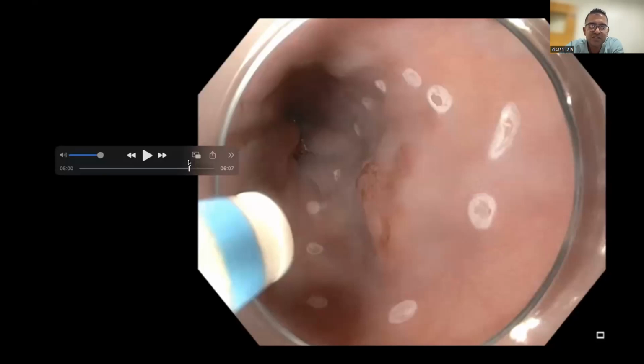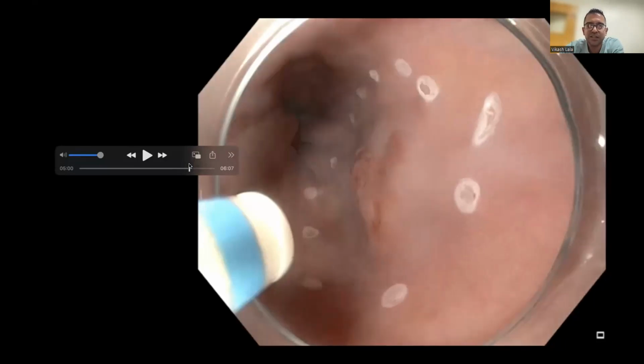But why I chose this case is to highlight again the importance of finding dysplasia within Barrett's and resecting it and not just RFAing it. And I think this is a follow on from a previous case. So had we just cut out those malignant areas and left that dysplastic area on top and RFA'd it, this is the potential it had of becoming. So this is what you want to avoid because this is a very difficult situation to deal with.